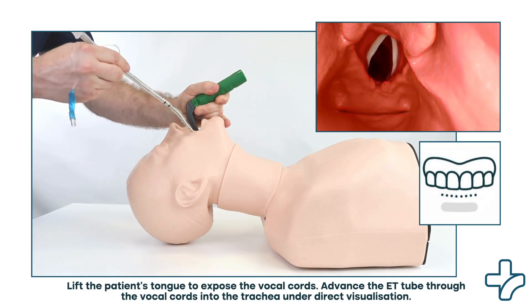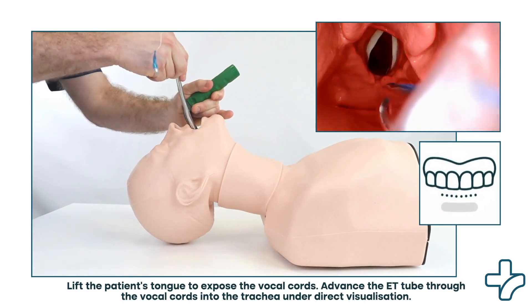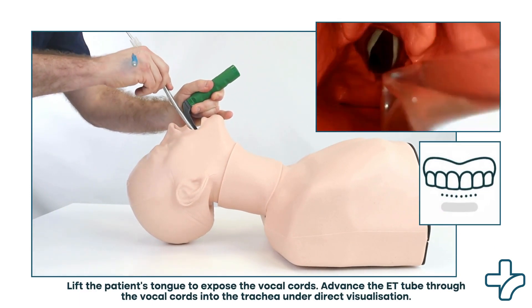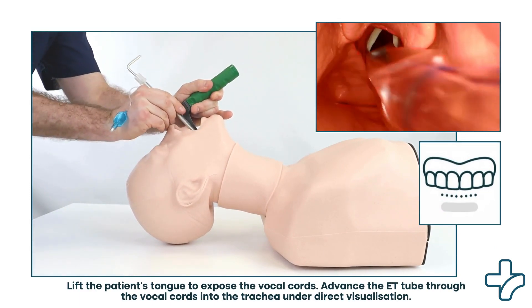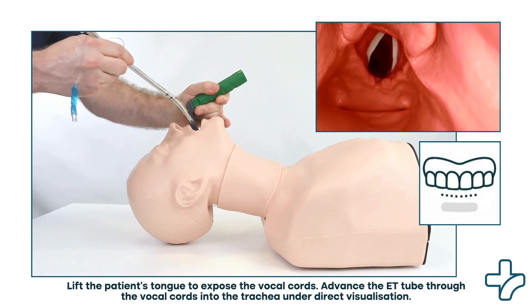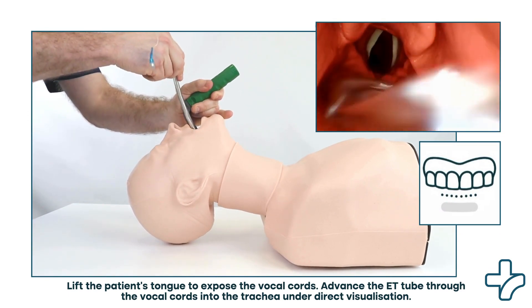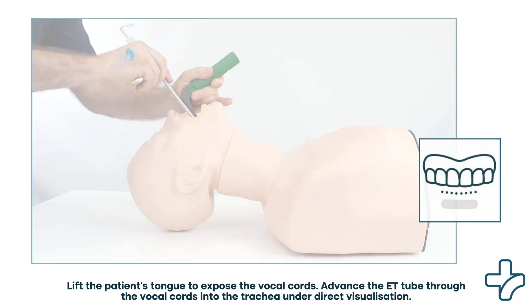Using the laryngoscope, carefully lift the patient's tongue to expose the vocal cords. Advance the endotracheal tube through the vocal cords into the trachea under direct visualization.